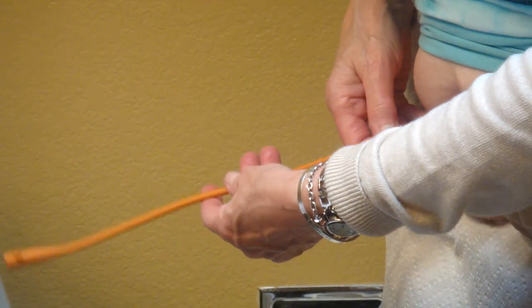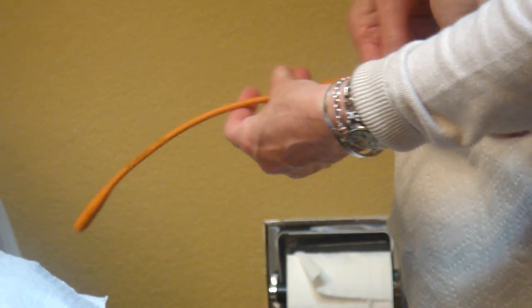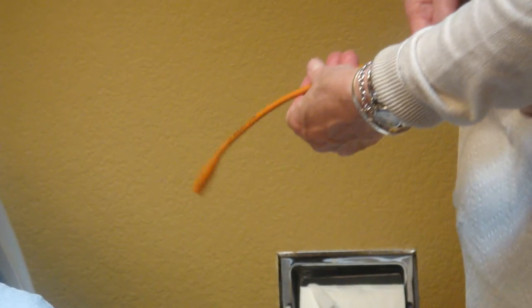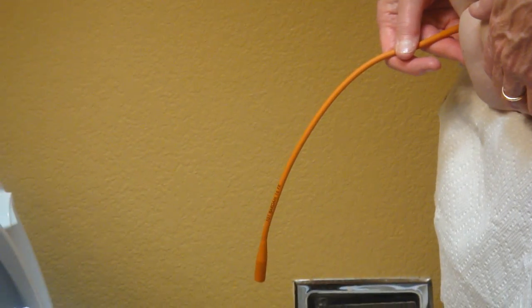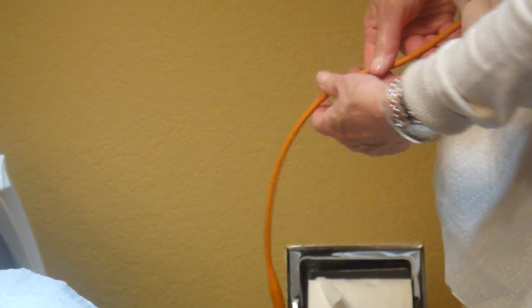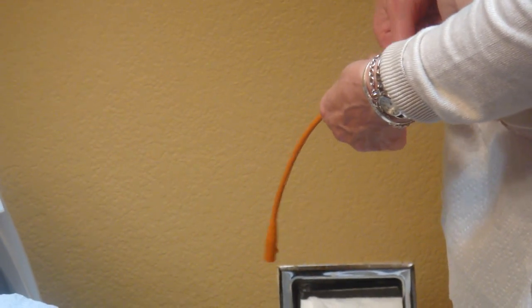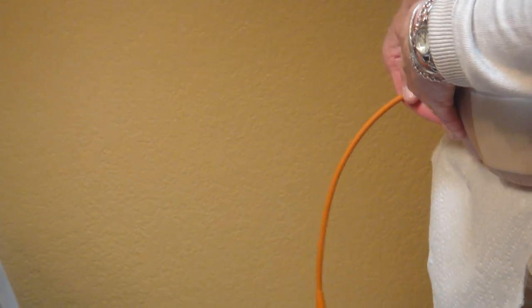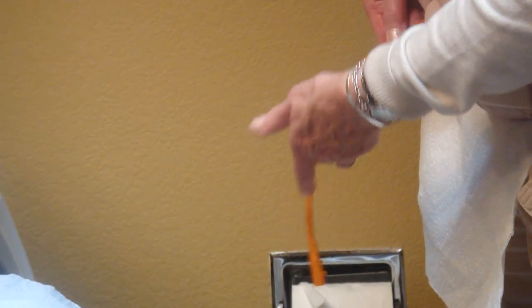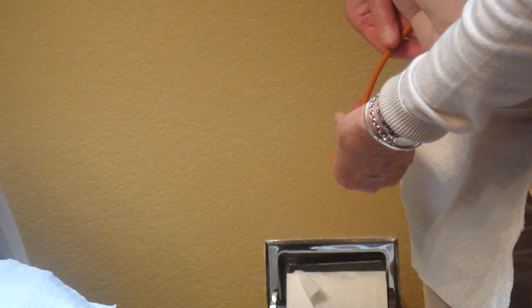I'm going to insert the catheter into the stoma. There's no sensitivity there, so it does not hurt to put the catheter in. If it glides right in, that means it's ready to go and it also means that I'm relaxed. If you don't relax these muscles, it's going to be more difficult to catheterize yourself. If you get it in at the wrong angle, just pull it out a little bit and start back in again, kind of work it in and out. You can tell if you're not going in correctly — you'll feel it. I'm in through the gateway now. There's a little passageway you can feel when you're past it, and that's what keeps the urine from coming out when you're not ready. It's going in very nicely and easily.